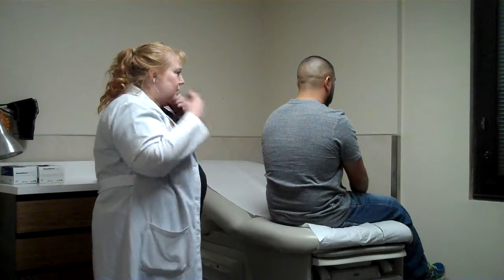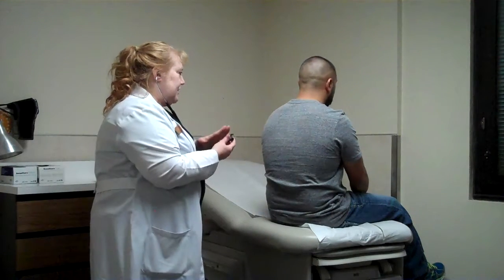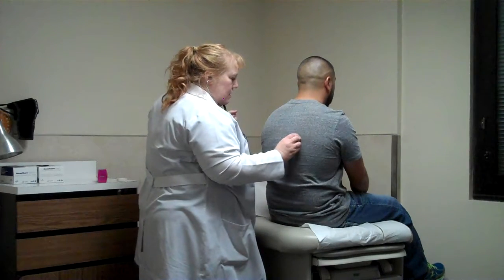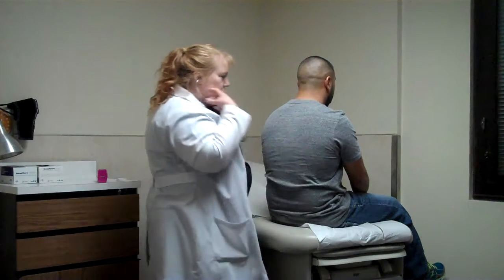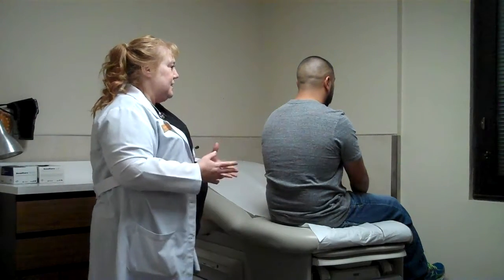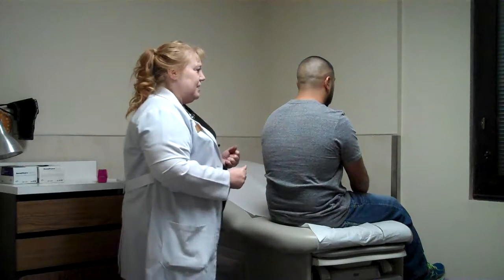Now, I'm going to do one more time, listening. This time I want you, what we call egophony, say the letter E when you feel the stethoscope touch. E, E, E, E, E, E. Good job. It came across as an E, so I didn't hear it as an A, which again was another test for consolidation. So, good deal. You don't have any consolidation.